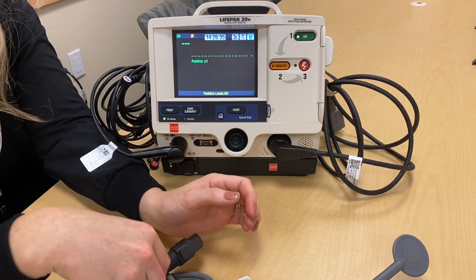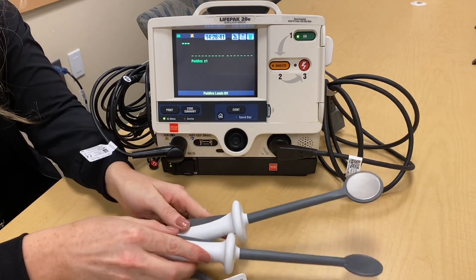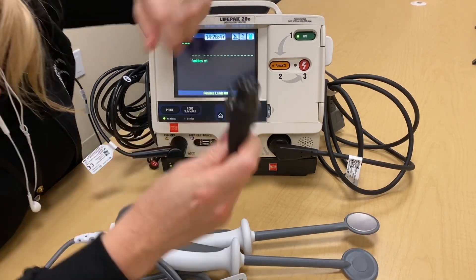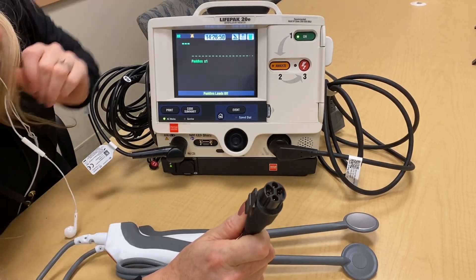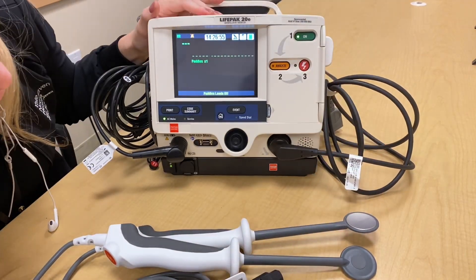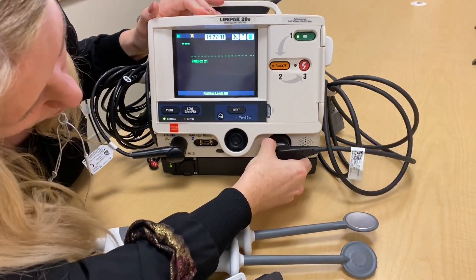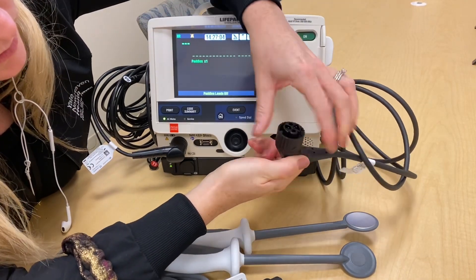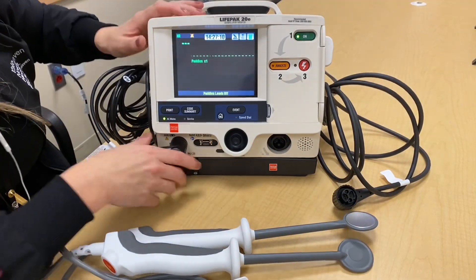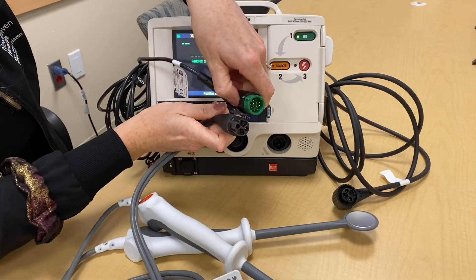Once you have retrieved the internal paddles from the back hallway cart and removed them from their packaging, you're going to attach them to your LifePak 20E. This is the cable you will be utilizing to attach, and this is where you will be plugging the internal paddles in. You know it's the correct area because when you twist and remove the cover, both have the same pattern. You know this is the incorrect area because it says ECG and the patterns do not match.